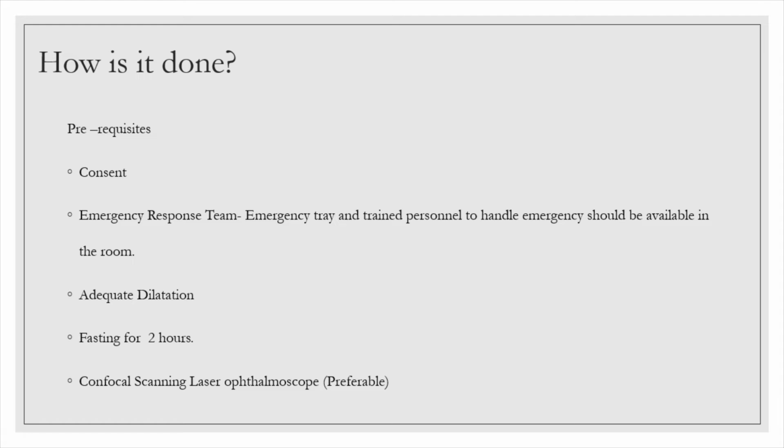You need certain prerequisites, which is basically consent. You need to have an emergency response team ready, even though the adverse effect rate is really low. You need to have adequate dilatation, and fasting for 2 hours is recommended. Confocal is preferable, though it can be performed with digital as well.